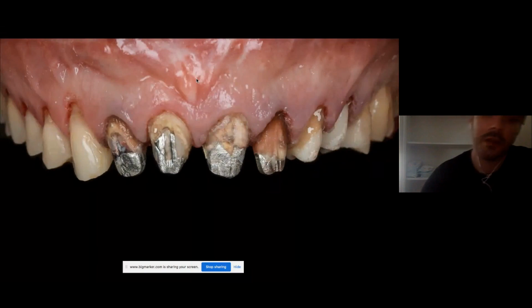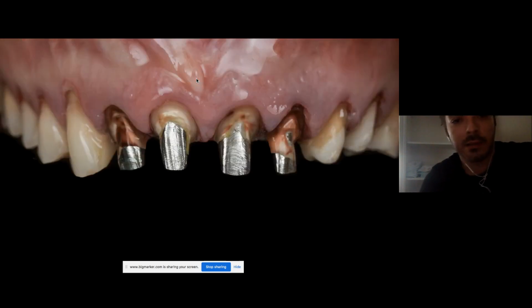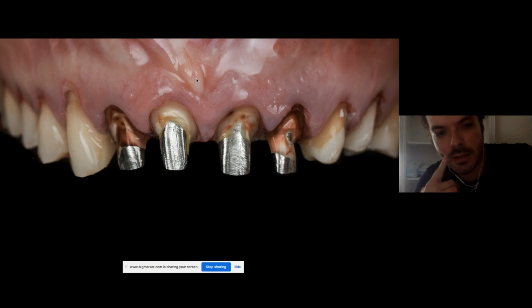So here we still have a couple of issues. Color of the substrate, because we're going to use monolithic material. So here when you don't layer, it can be challenging. And this is something very nice, which I will show you today, that is going to be published in QDT 2021. It's a technique that we have been using ever since. In this case is already, I think, 1 year old.